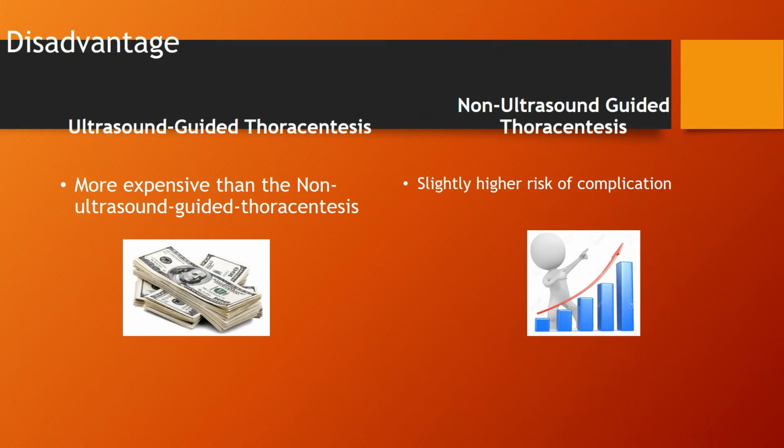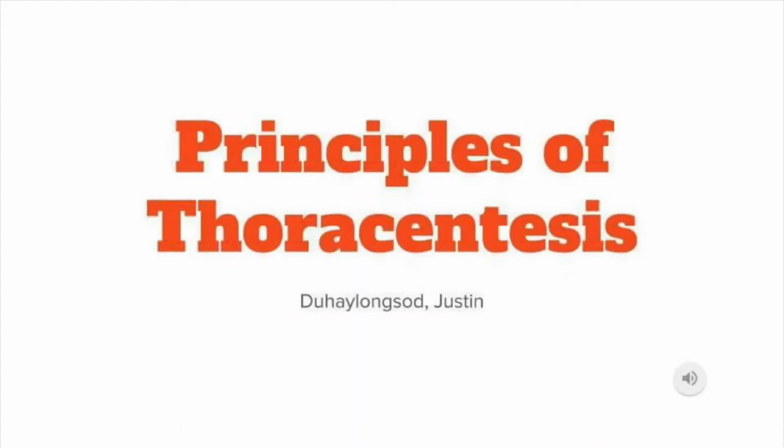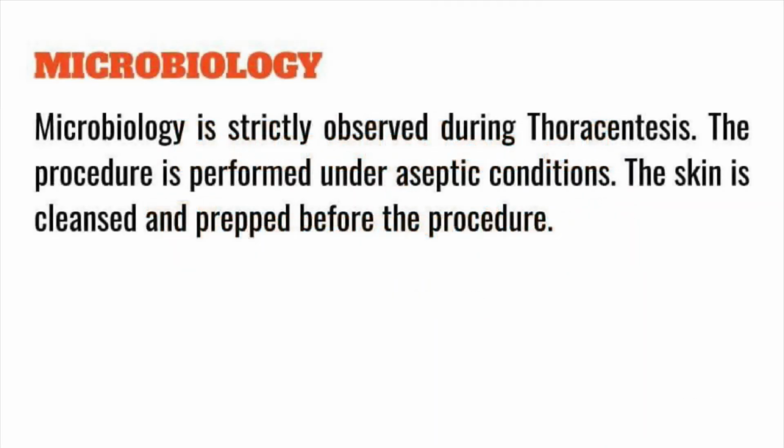The disadvantage of ultrasound-guided thoracentesis is that it is more expensive because the patient is paying for the ultrasound, while non-ultrasound guided thoracentesis carries a higher risk of complication due to the absence of ultrasound. Principles of thoracentesis. First, we have microbiology. Microbiology is strictly observed during thoracentesis.